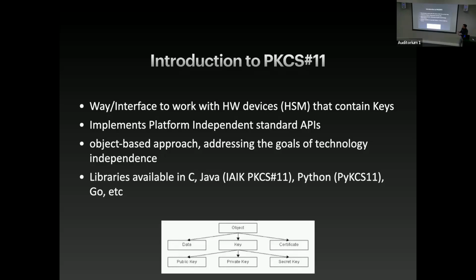According to the standard, everything is just treated as an object. There are a lot of objects like data, key, certificate, public key, private key, secret key. This is again to make it technology independent and platform independent.